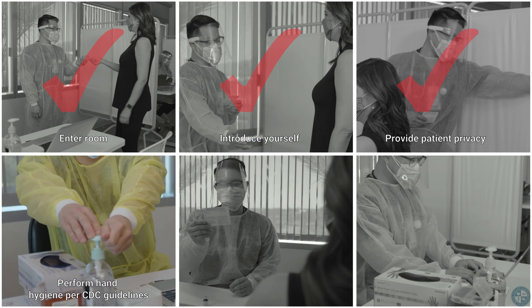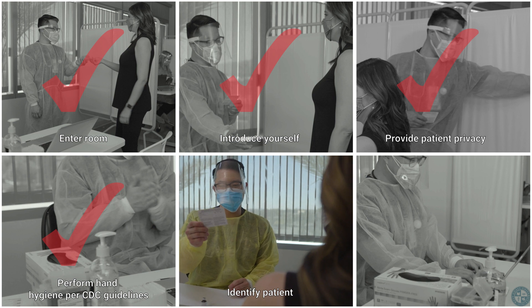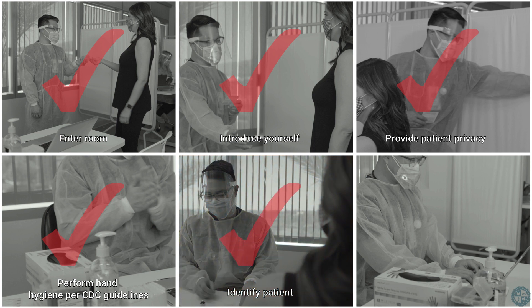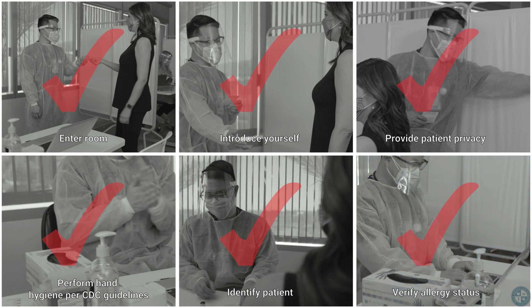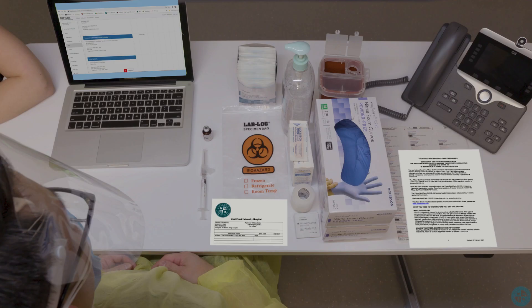Perform hand hygiene per CDC guidelines. Use two identifiers to correctly identify the patient. And verify the patient's allergy status. There are specific supplies needed in order to conduct IM administration.